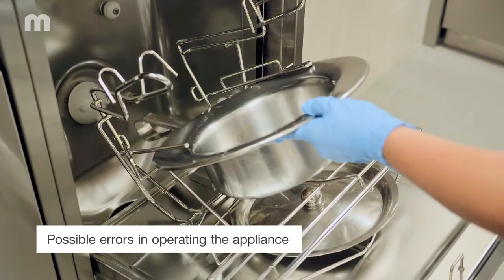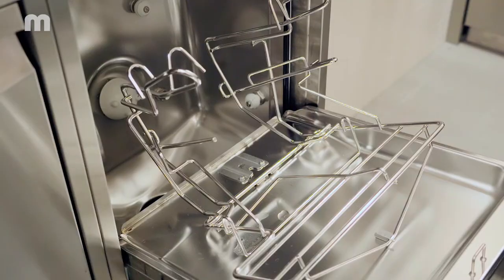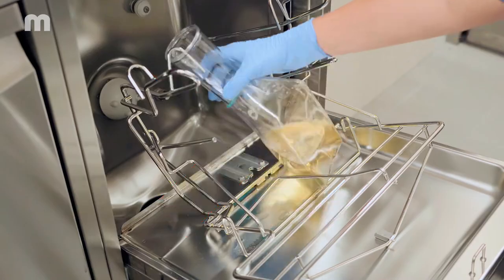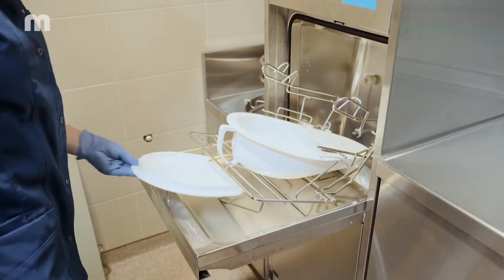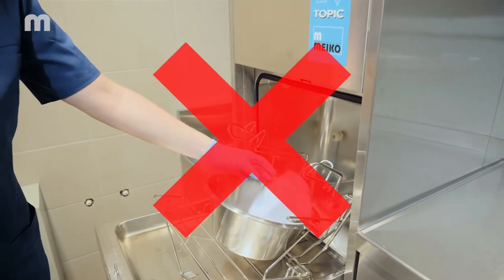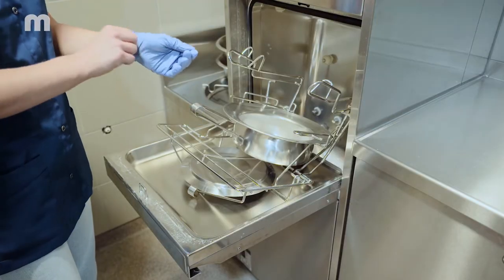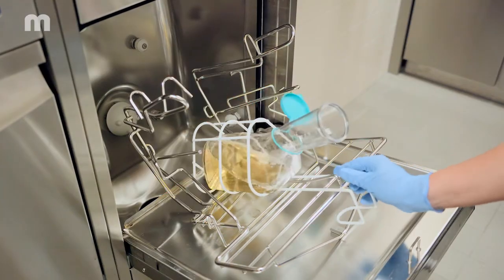For the best cleaning results, the care utensils must be placed in the bedpan washer disinfector's holder correctly, meaning in accordance with the instructions or the diagram in the instructions for use. Only use the bedpan washer disinfector for cleaning the utensils it is intended for — not for nappies, sanitary towels, flower vases, trays and similar things.